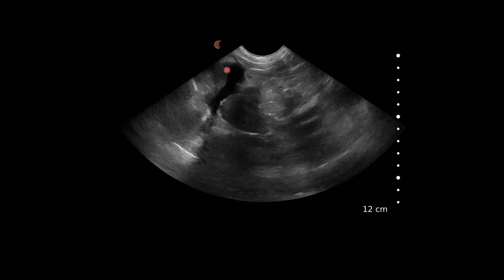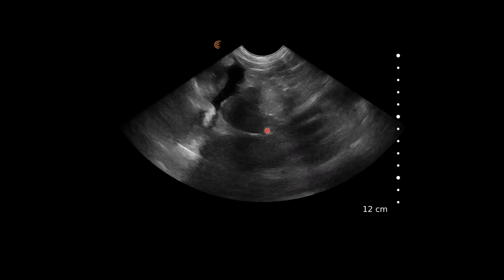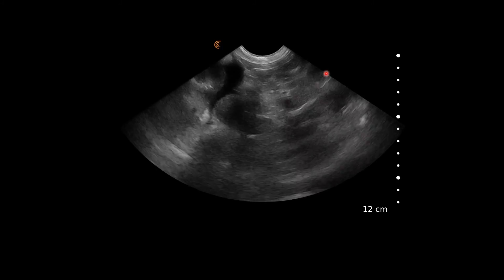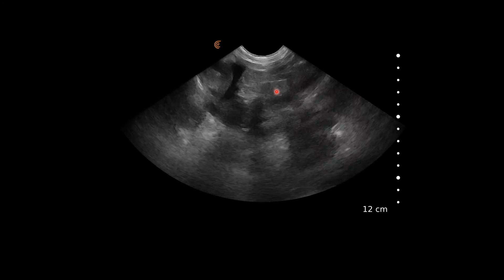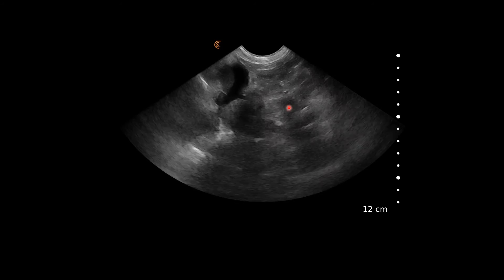Again, the left adrenal is seen here with the kidney popping into view.